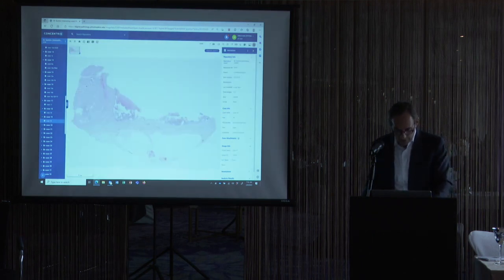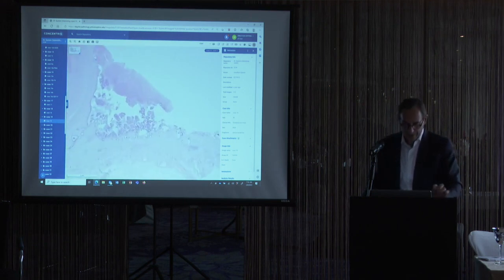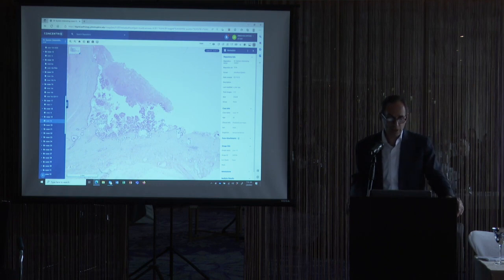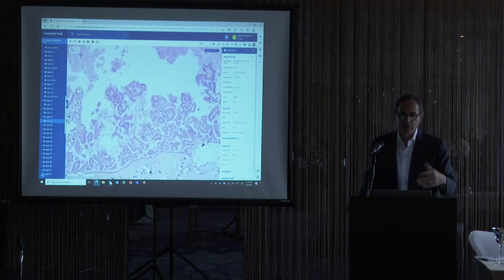This is a paratesticular lesion. You can see the testis is normal. Whenever you're looking at a testis orchiectomy or biopsy, you always want to separate out whether it is paratesticular or intratesticular, because often very different lesions will enter into the differential diagnosis. In this case, we have a paratesticular lesion, so we don't have to think of germ cell tumors.